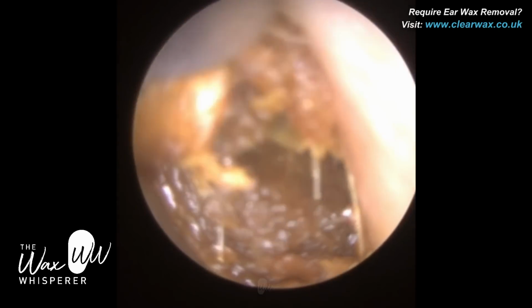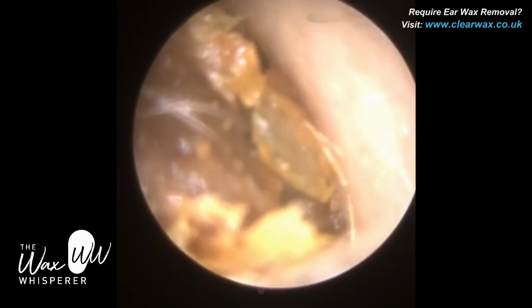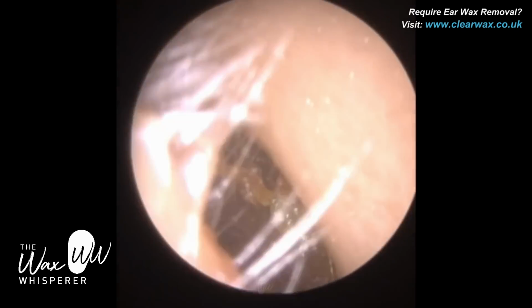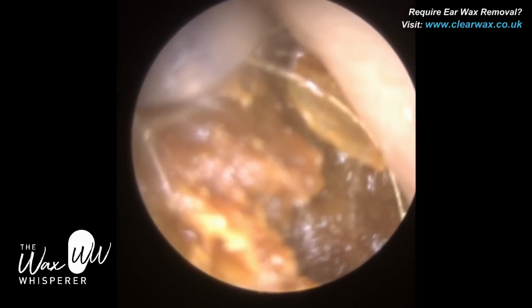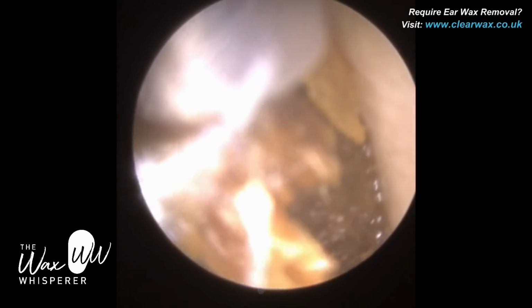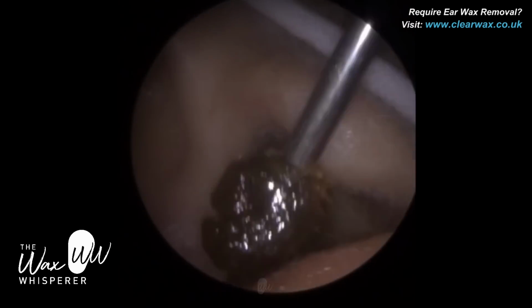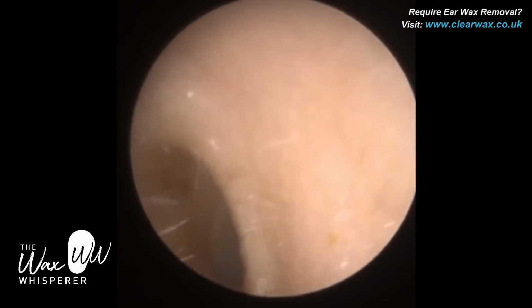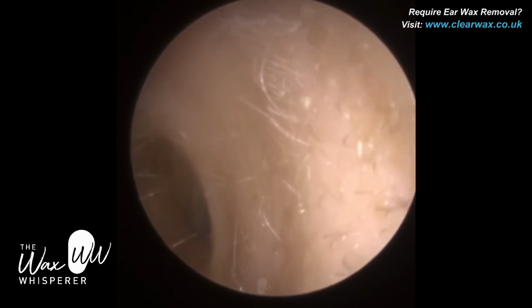When the wax is quite dry like this, sometimes inadvertently, when you're positioning the suction probe, trying to suction the wax plug out, you can actually push it in, so you just have to be careful. I didn't use an ear hook initially because the wax was quite deep medially, so I try to avoid using hooks and scoops in the inner two thirds of the ear canal, the bony part, the sensitive part, and that's the patient's eardrum. It's a textbook eardrum.